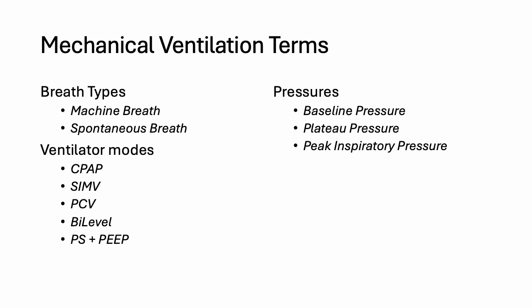Some other mechanical ventilation terms include these. You know that you and I are breathing spontaneously, so those are considered spontaneous breaths. But on a machine, you're also allowed to take spontaneous breaths, and we will differentiate that later. How do you differentiate a machine breath versus a spontaneous breath? I will discuss that later. Then there are the different ventilator modes. Regardless of manufacturer or brand names, they all fall into combinations of these, so in principle these are the generic names for the ventilation modes.